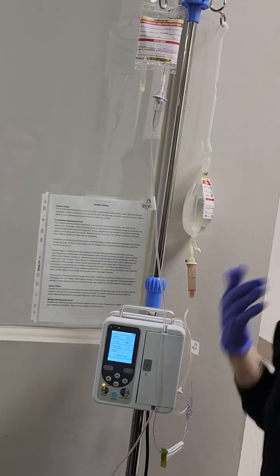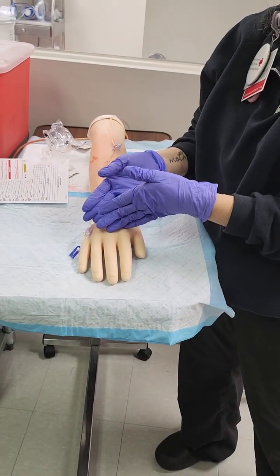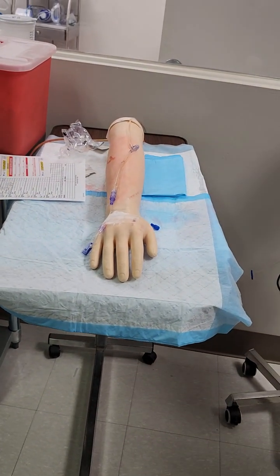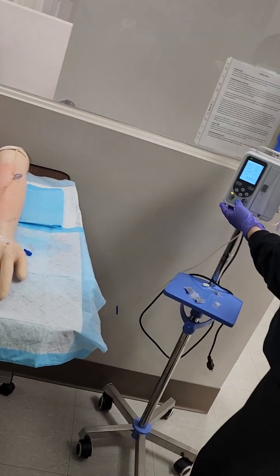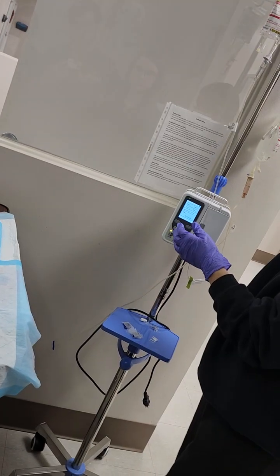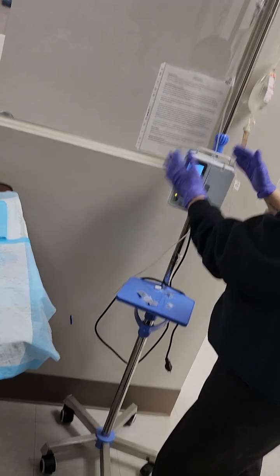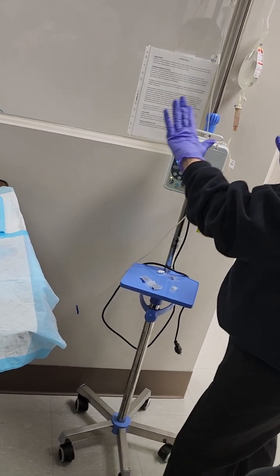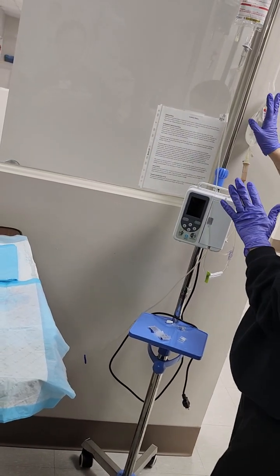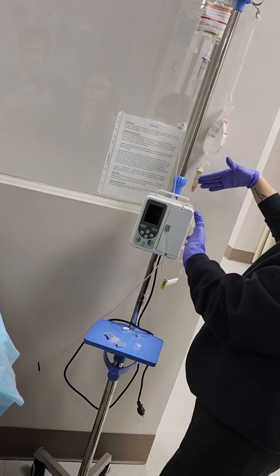So it's dripping, and I'm going to check my IV site, make sure my patient's tolerating it, it's not swollen, they're not having any pain, no complication. Questions on that? So is the primary still going? No, the primary is paused because it's lower. Yeah, it's kind of like physics. Unless it's a multi-chamber pump, which can infuse multiple things, if it's a single chamber, it stops the primary and this one infuses over an hour. When it's done, the primary automatically takes back over. That makes sense.